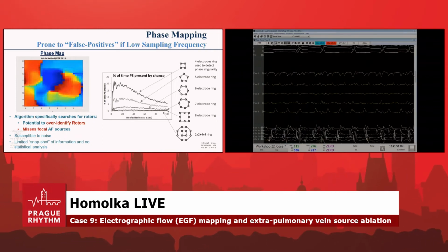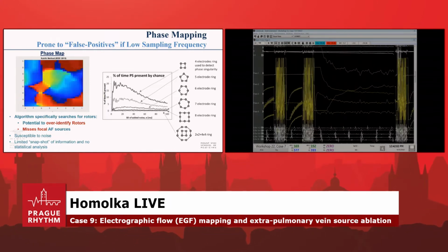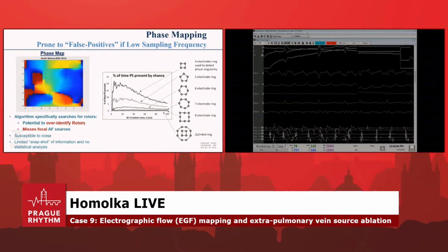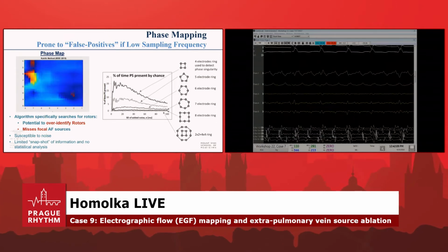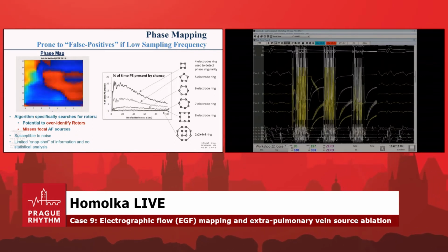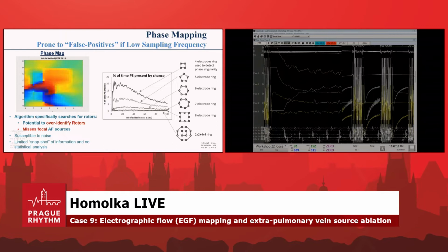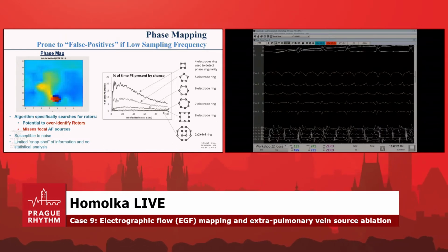And what you see is with the low density ring, the 4 electrode ring, you have lots of times when rotors were identified, even though it was all just noise. So it's when you have high density that you can get good data. With low density, you cannot get good data. So that's one of the big problems of phase mapping, the possibility of false positives with low sampling frequency.